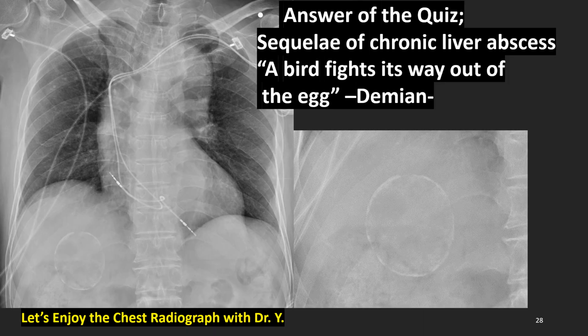Now we have finished session 15 on adenocarcinoma of lung cancer. A very varied spectrum of findings, from ground glass nodule to huge mass and to airspace consolidation. The spectrum is very wide, and most importantly, adenocarcinoma is increasing and is the number 1 lung cancer subtype. We must remember the importance of adenocarcinoma and the spectrum of the radiographic findings. Okay, congratulations on finishing session 15.